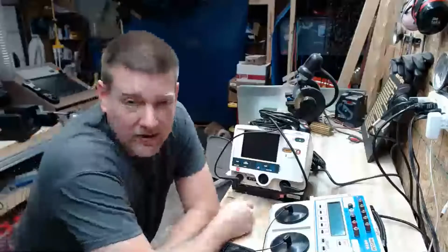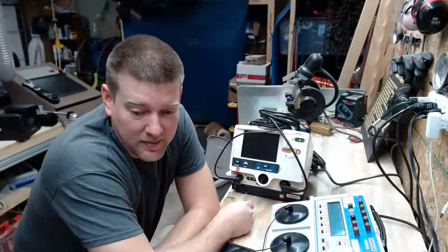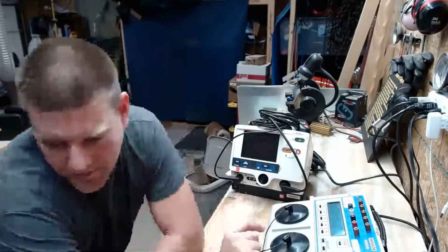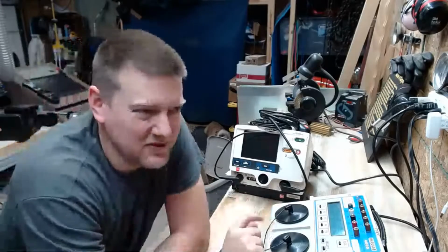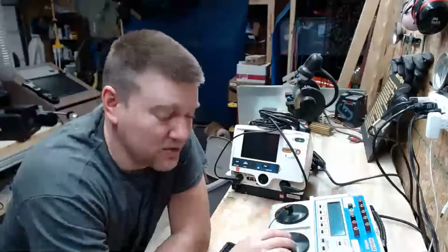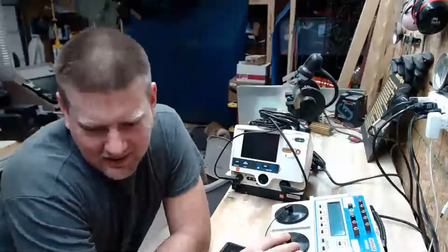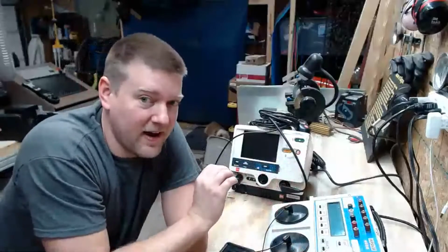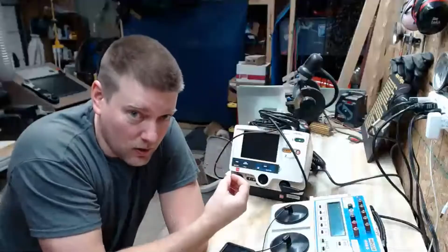Make sure that the port is good, and it's up to somebody else to worry about the internal paddles and to make sure that stuff is good. Yeah, that's a slippery slope. Anytime you deal with central sterile, it's a slippery slope when it comes to whose responsibility it is. We try not to take too much responsibility, because once it leaves my hands, I can no longer certify that unit is good to go.